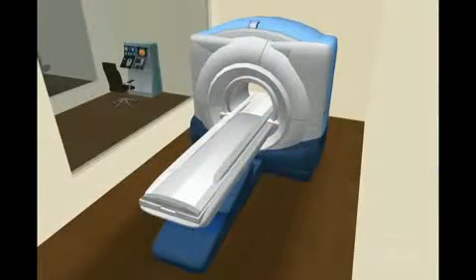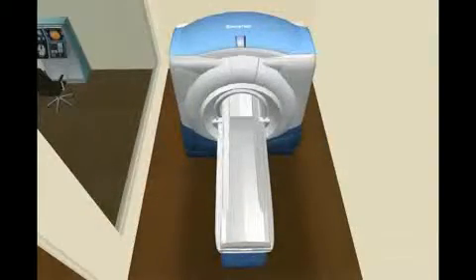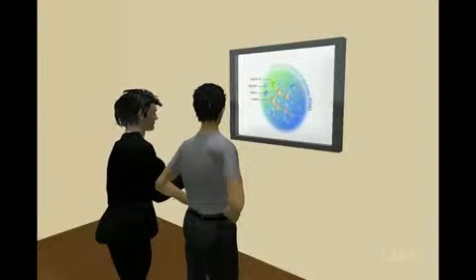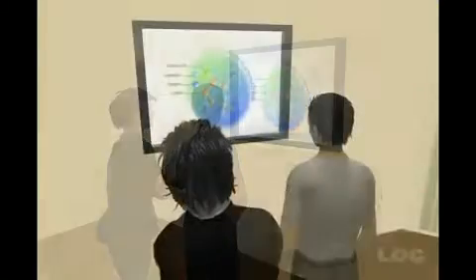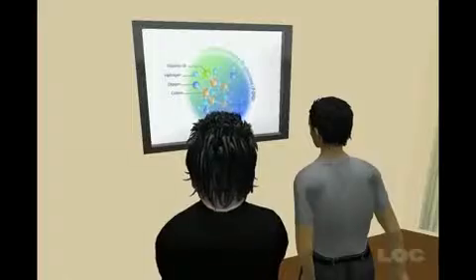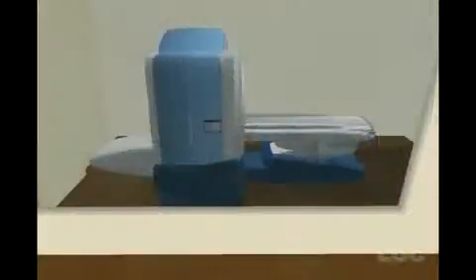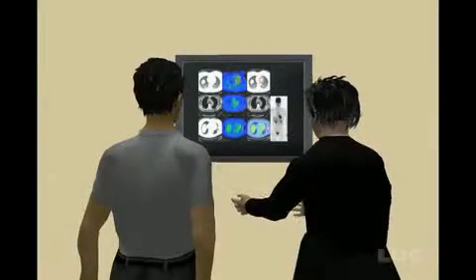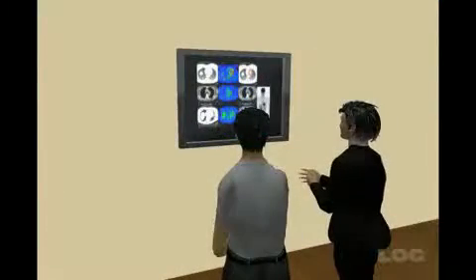The latest development in scans is the PET scan. PET stands for positron emission tomography. In this scan, you're given an injection of a rapidly acting radioactive substance which disappears from the body in a few hours. The commonest substance that is used is a radioactive form of glucose. A PET scan is not as good as a CT or MRI scan in giving a good three-dimensional picture of the body, and is therefore usually used together with a low-dose CT scan to help produce a better picture.